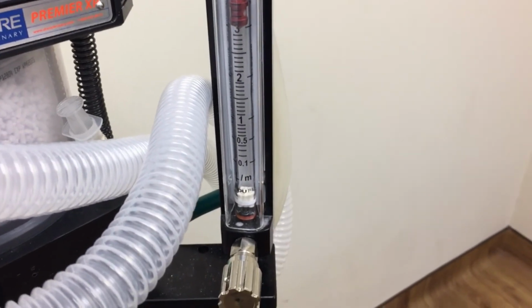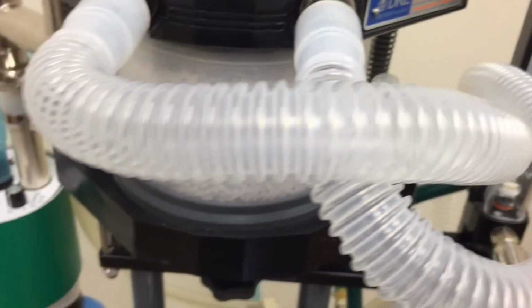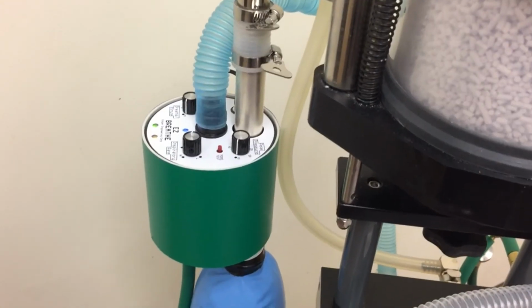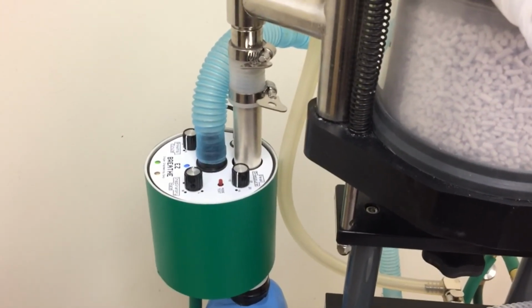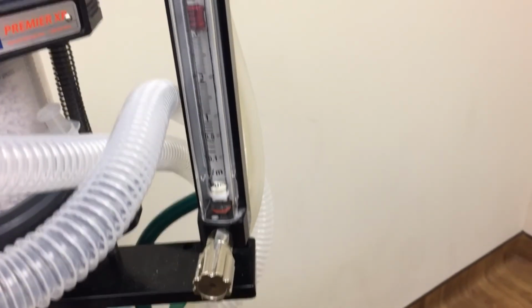Once the patient is being ventilated and the machine is cycling properly, then go back to look for the cause of the problem. Checking the cuff, checking the scavenger if necessary, checking your oxygen supply.